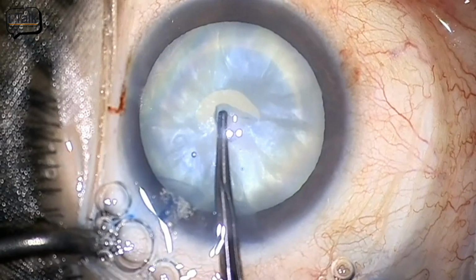Now this intralenticular fluid, when it has to be aspirated, you would have seen that I have put the bevel down, because at times when I used to place it bevel up, there never used to be that much aspiration of the highly liquefied intralenticular cortex.